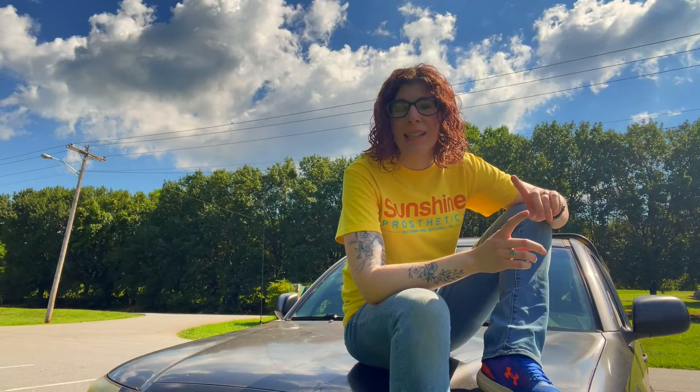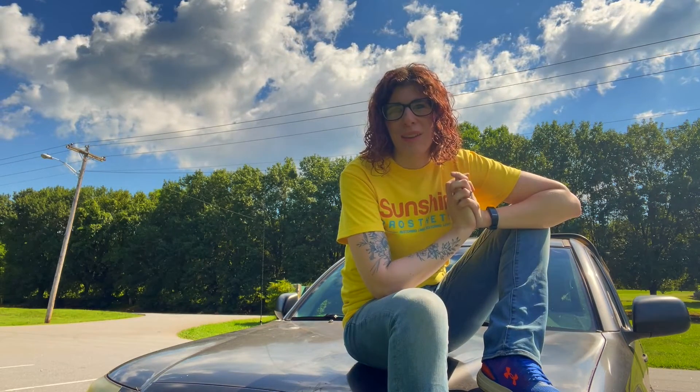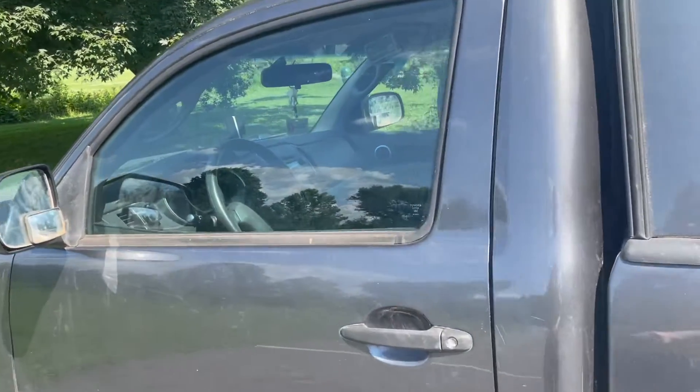I'm going to be taking you guys on a tour of Little Tank, and if you are curious how Little Tank got his name, go ahead and comment down below and I would love to share that story with you. So we will get started in the cab.